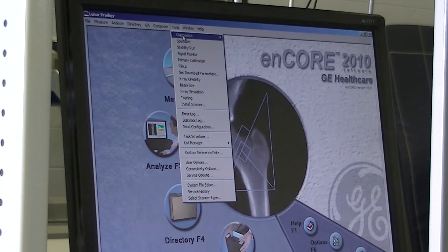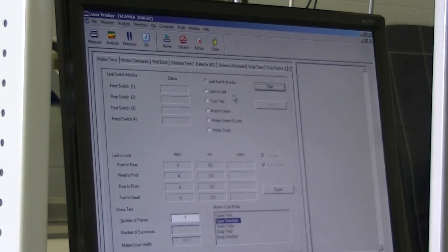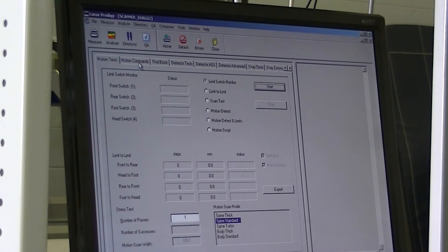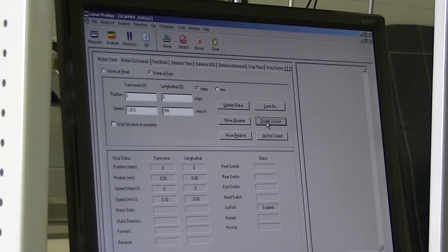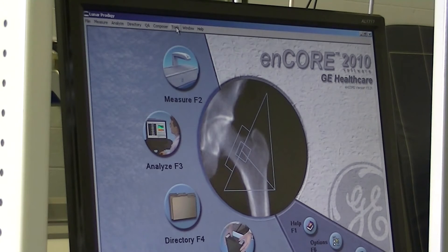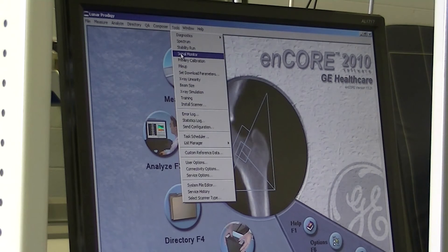So we go to Tools, Diagnostics, Scanner Motion, Motion Commands, Enable Joystick. When we enable the joystick, we're going to move the arm to the middle of the table. After the arm and tube are in the middle of the table, click Close, Collimator, Tools, scroll down to Signal Monitor.